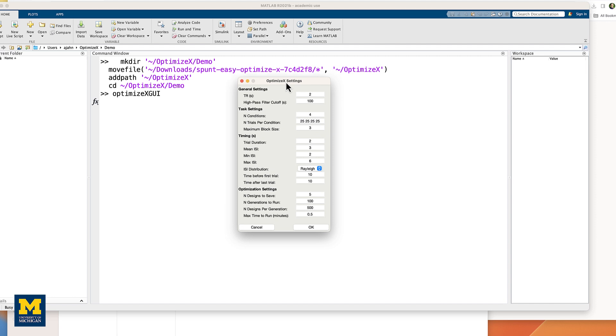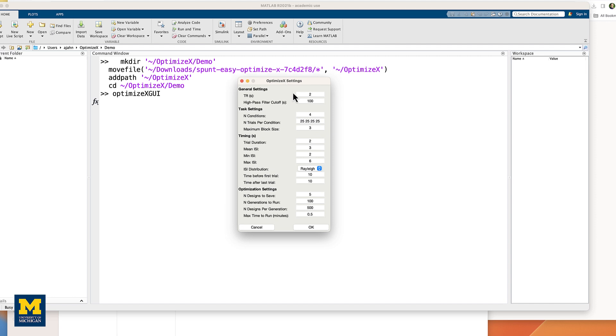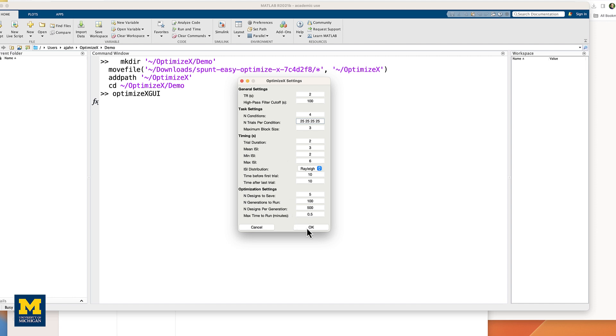Many of the fields are intuitive, such as TR, number of conditions, high-pass filter, number of trials, and so on. More details about the other fields can be found on the OptimizeX website. For now, leave the defaults as they are, and then click OK.